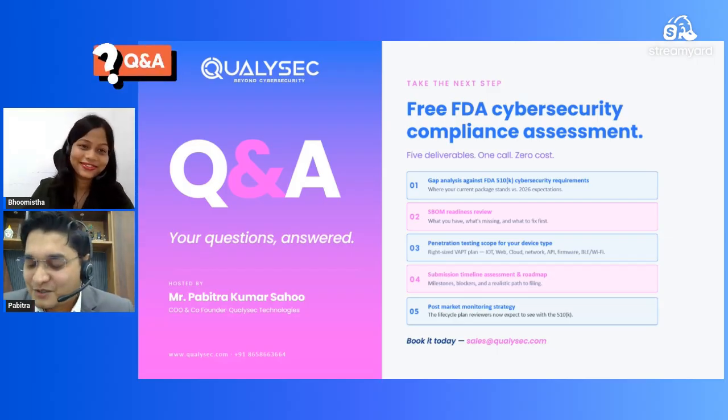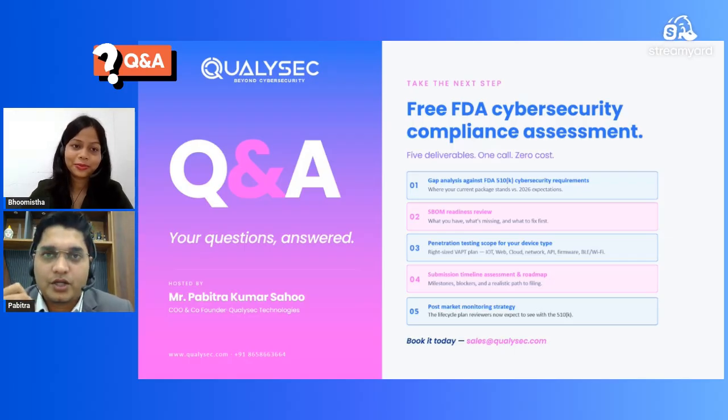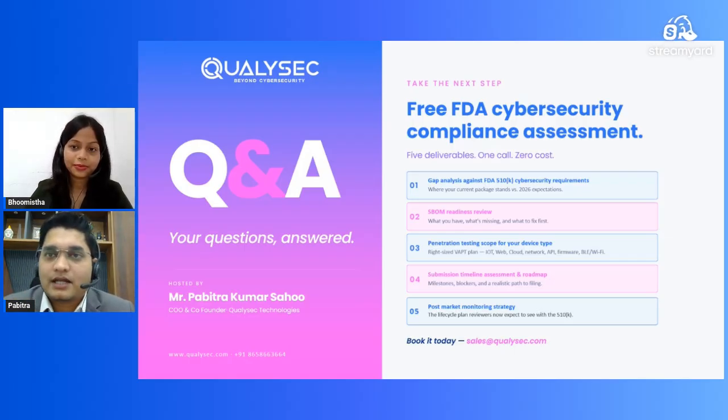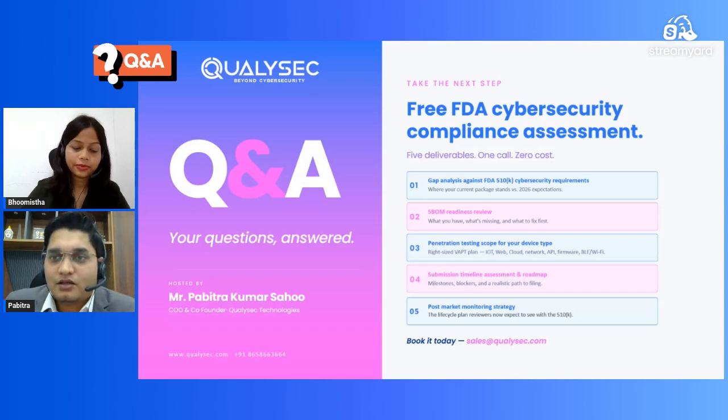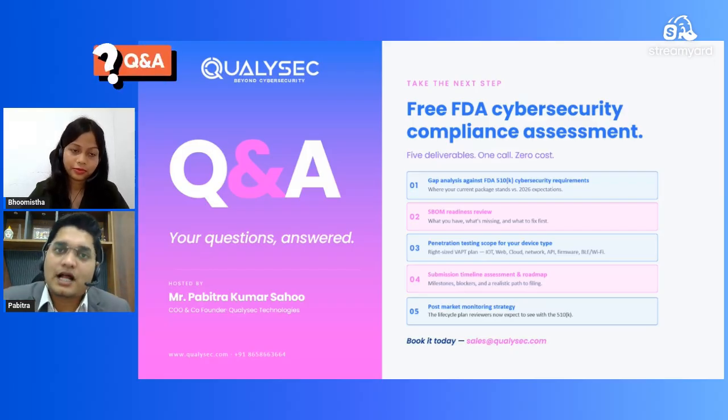Okay, so SBOM is not like you're going to give your secret to the auditor or the FDA. Imagine you are running a shop. If you don't know what inventory you have and how you will manage it, this is what security posture also is. Right now 75% or more, what I personally believe, you are using third party components to build a medical device. So to have an inventory list, it actually boosts your security, it's not giving away any secret.